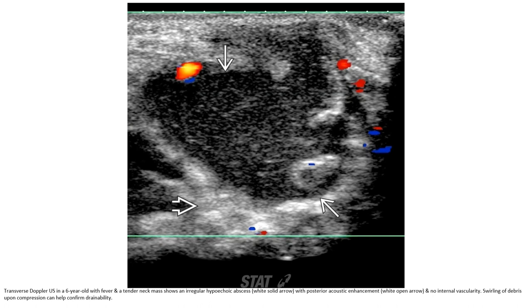This is the Doppler ultrasound in a six-year-old with fever and a painful neck mass. It shows an irregular hypoechoic abscess with posterior acoustic enhancement and no internal flow on color Doppler. Swirling debris upon compression confirmed drainability.